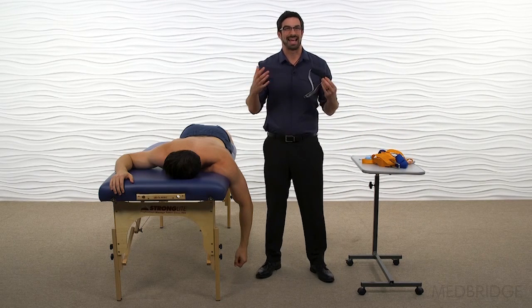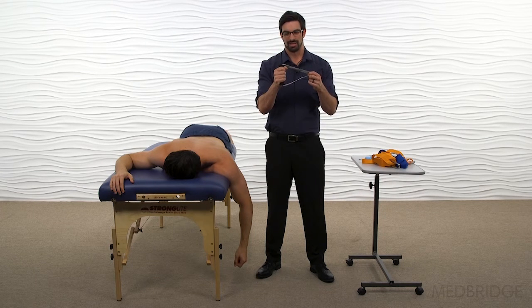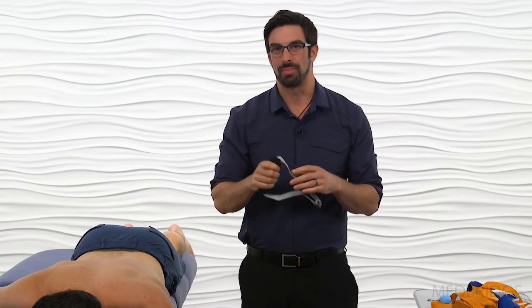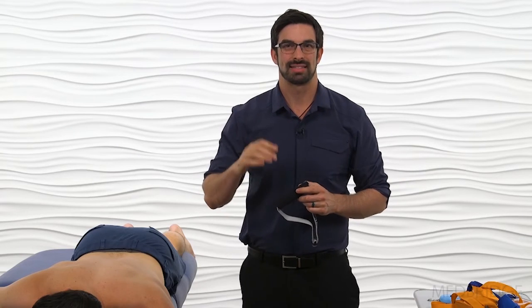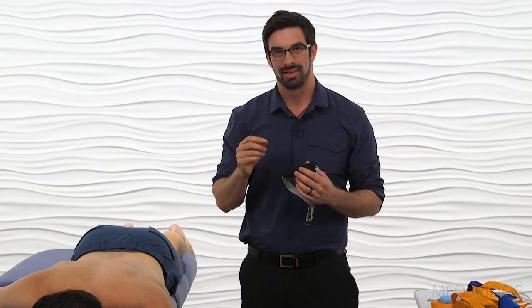If you want to put some attachments, you can take a handle and have the patient grab it and press out. You can put a baseball in their hand — you can do any type of thing to simulate or mirror what they need to do in their sport. But the most important thing is that you get that quantification, that MVIC, and then compare it strength-wise to the opposite side.